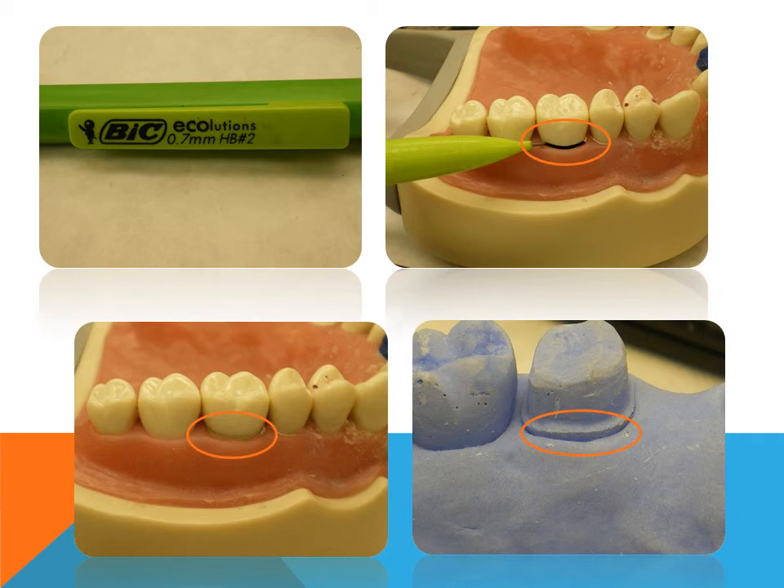On the typodont, it is recommended to maintain the margin slightly above the crest of the rubber gingiva. A pencil mark is placed to guide your reduction.